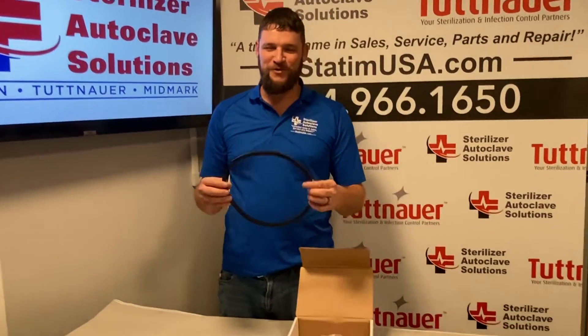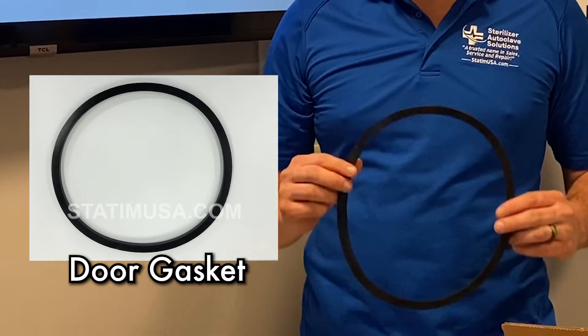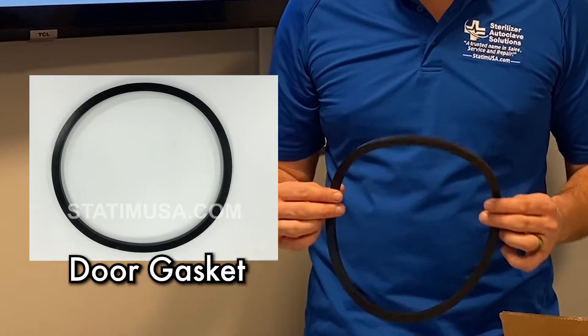This kit comes with a door gasket. The door gasket is included in the annual preventative maintenance kit. However, if you are doing consecutive cycles or back-to-back, this will wear out and it might need to be changed more frequently.